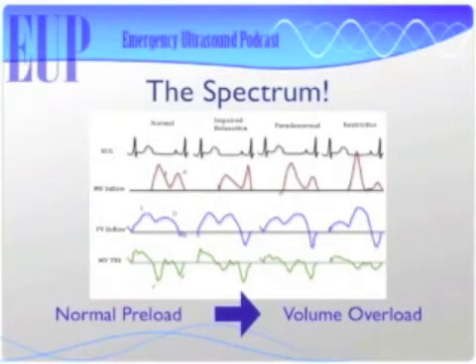But I think where Rivers falls short is in these really sick patients, the ones where we really need to evaluate their heart function a lot better and really understand what the preload is to their left ventricle. So when I say if their IVC collapses less than 50%, they won't respond to fluid. If it collapses more than 50%, it will. This is why you always roll your eyes when I say that, right? Because it's more complicated. But how often will that not work?